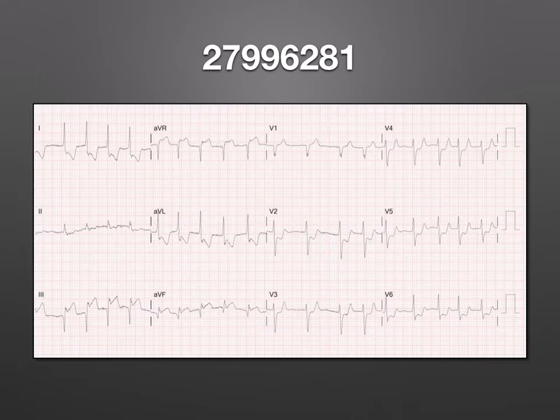Now for the ECG, and what we see is a pretty convincing inferior ST segment elevation MI. We see the elevation in lead 3, we see it in AVF, and we see nice reciprocals in 1 and AVL, and we see it across the rest of the lateral leads. Well, for that matter, we basically see it everywhere, except in AVR. So, an interesting little aside, elevation in AVR, while we do not call that diagnostic for STEMI, in conjunction with an inferior, is pretty concerning for a proximal left main occlusion.